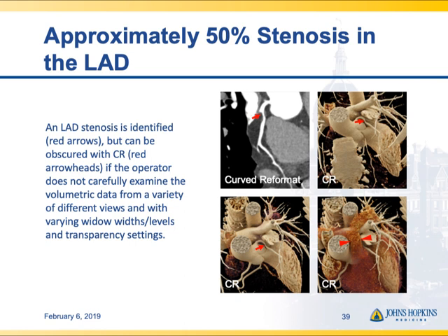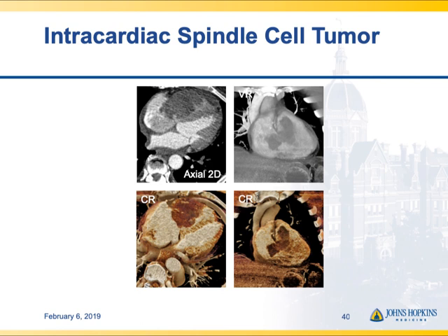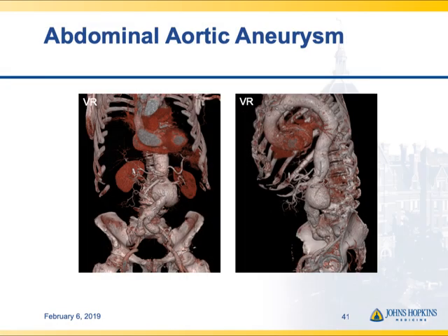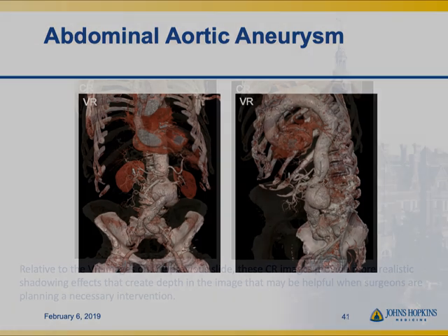If you've improperly chosen your windowing and don't have the right presets, the main pulmonary artery can actually obscure your pathology in the LAD stenosis case — shown in the bottom right panel. You really have to interact with the datasets and get a variety of views to not miss pathology. Here's a patient with an intracardiac spindle cell tumor — you get a nice sense for how the tumor interrupts the contrast column within the heart chambers and a bit of the tumor's texture on the cinematic rendered images.